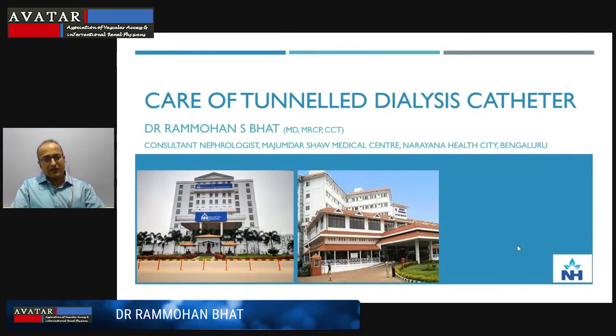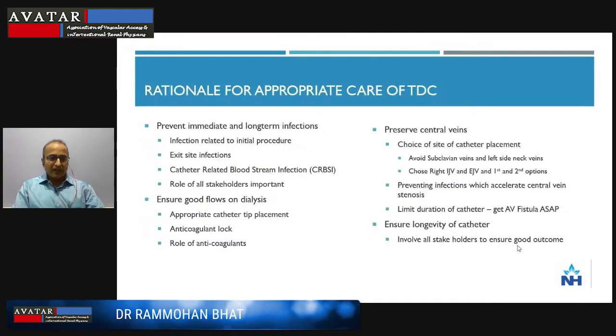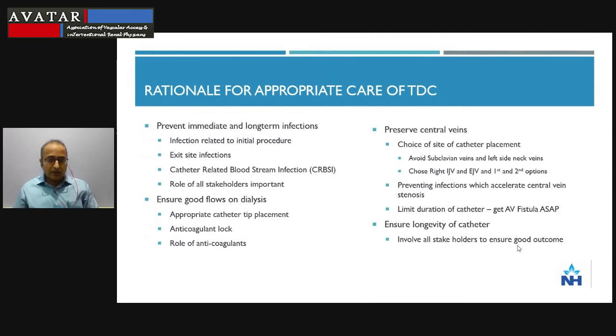My talk is on care of tunnel dialysis catheter. I would like to talk on these points. For time constraints, I'm just going to run through. Most importantly, I would like to stress why we should give importance to care of catheter. It is necessary to prevent immediate and long-term infections, which have an impact on central vein stenosis, one of the key topics being discussed in this conference.